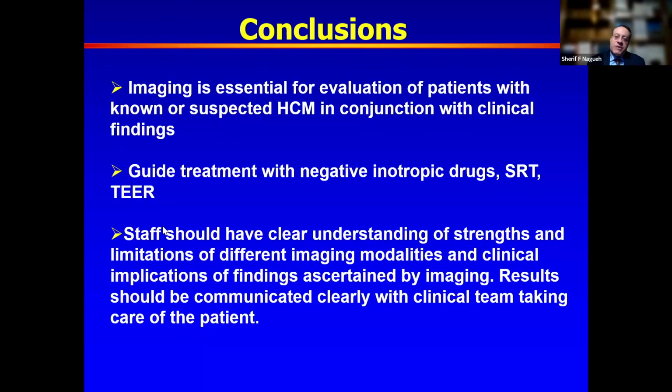Once the patient finishes the exercise, they want to acquire the gradient, and they would also recognize that this is the primary focus of the test. Do not look for wall motion. Go for the gradient. Be satisfied that I got the peak gradient post-exercise, if it is the treadmill exercise, and do not worry about wall motion.